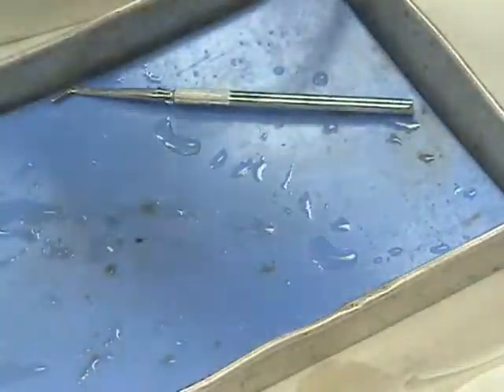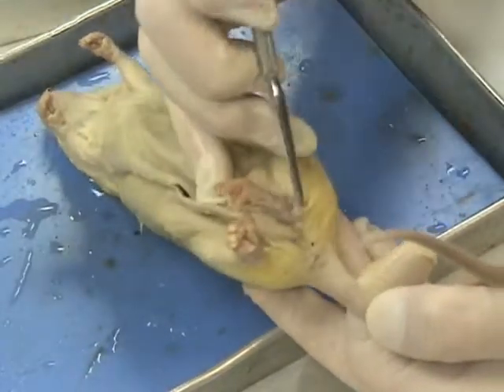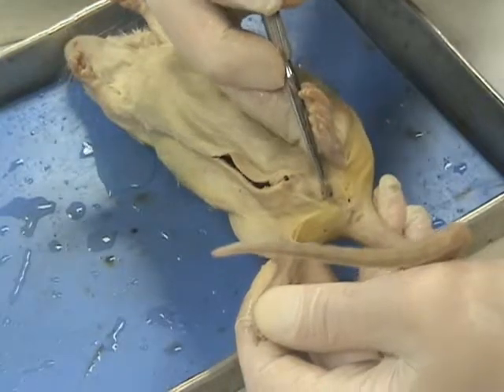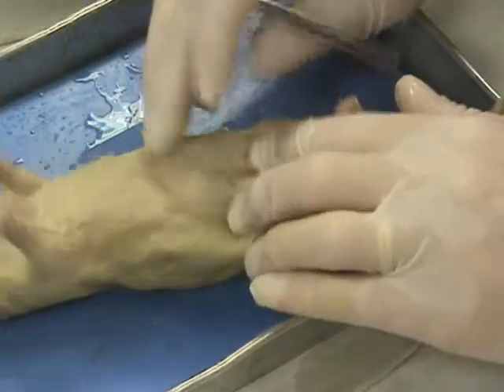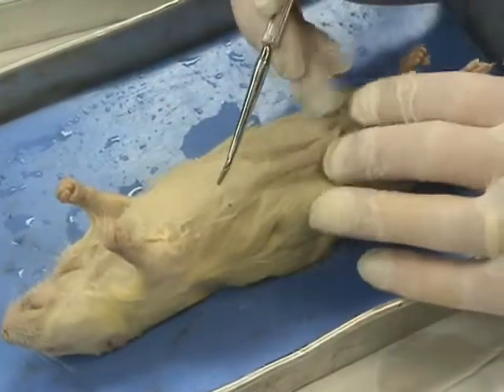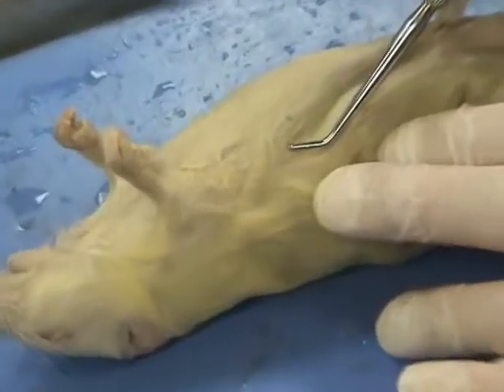For that female rat, again, the anus, and then anterior to the anus we have an opening here, and that opening, if I separate these feet out a little bit for you, this opening is called the vagina. The vagina has the urethra on the anterior end of the vagina, and in addition, we were asked today to figure out how many nipples the rat has. Now, on a female, it's going to be a little bit easier than a male. Males do have nipples though, and generally it's 10 nipples. There's an example of a nipple right here, if we can zoom in on that.